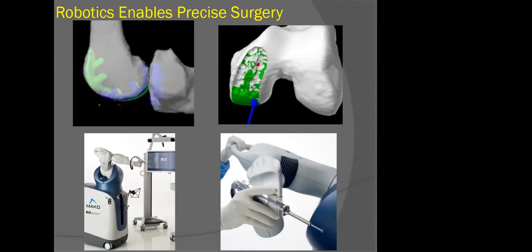The concept in the end is simple. We get a CT scan of the entire extremity. We have now a 3D model of the entire bone structure. In surgery, we make measurements to ascertain the mechanical and biomechanical aspects of the knee function, not just the ligaments that support the knee joint, but also the mechanics of the kneecap, which is critical for joint motion and function.